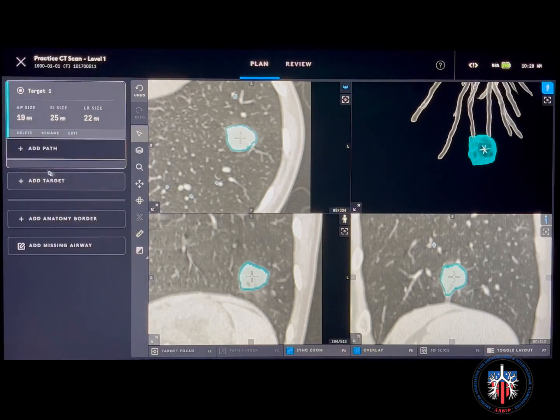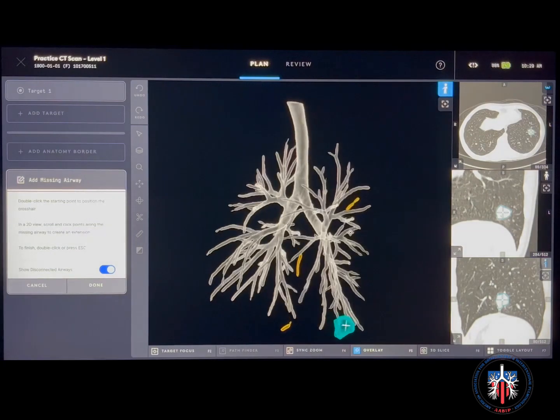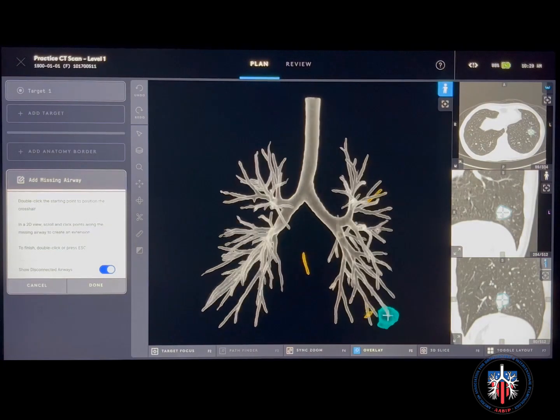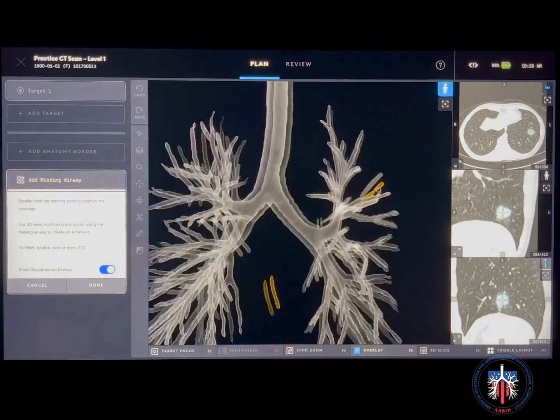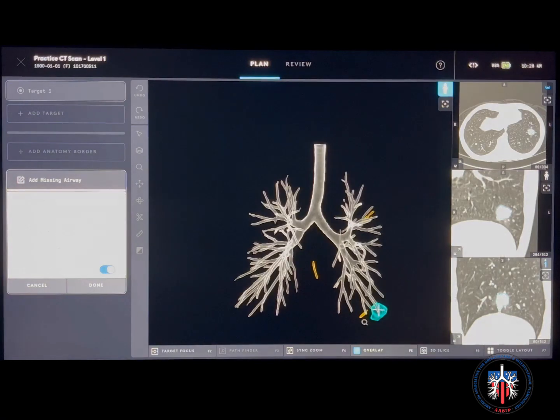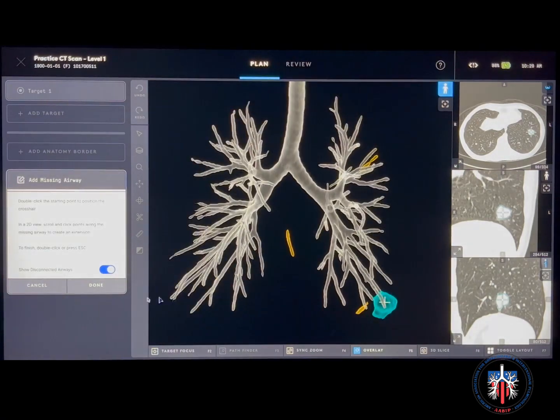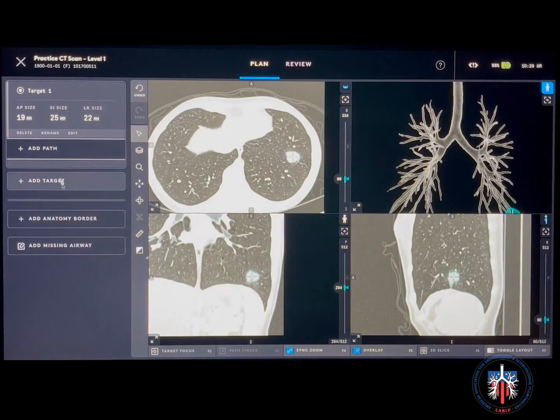Once added, you can delete, rename, or edit the nodule target. The software can identify missing airways, highlighted here in yellow. Missing airways are distal airways that were omitted from the 3D airway tree due to an interruption in the more proximal airway branch on the CT scan. You have the option of manually reconnecting them.